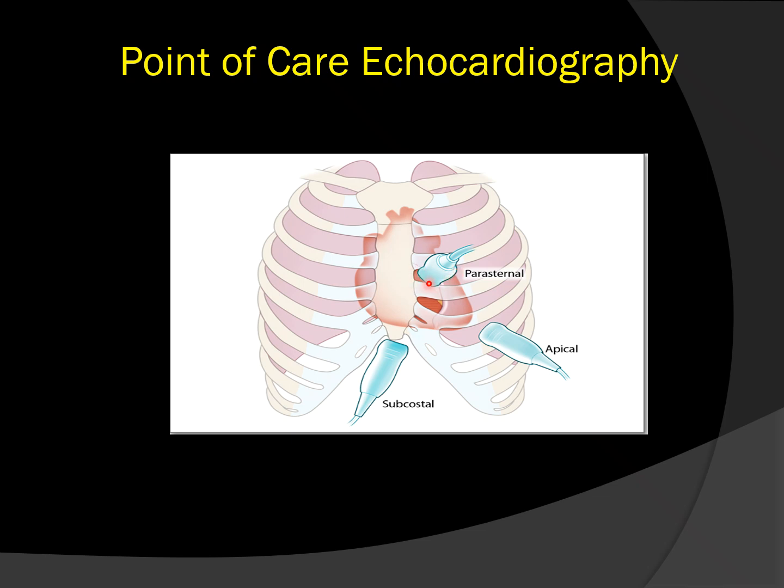You will notice that we will be using the phased array probe. The advantage of the phased array probe in echocardiography is its small footprint, thereby giving us an opportunity to access the heart through the intercostal spaces. Also, the phased array probe is a low frequency probe, which allows us to get several centimeters deep so we can view the heart in its entirety.